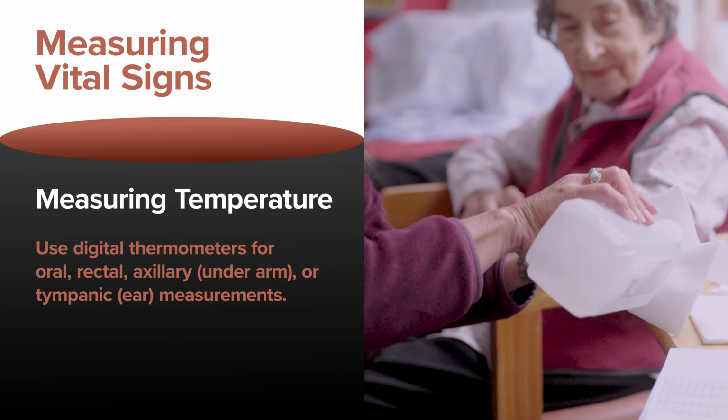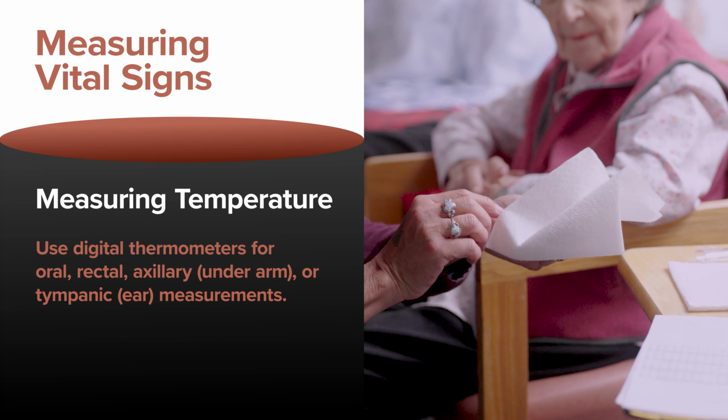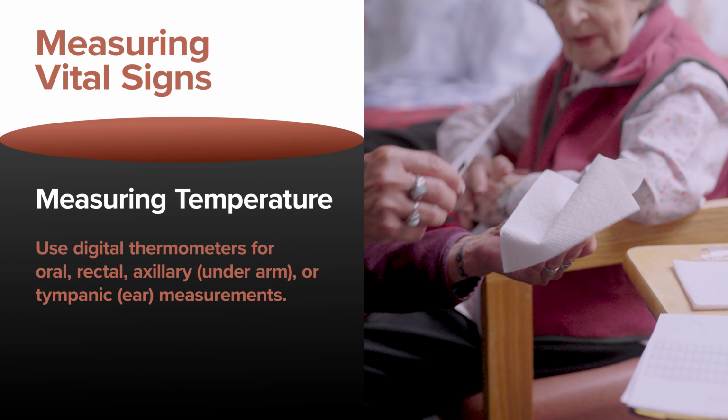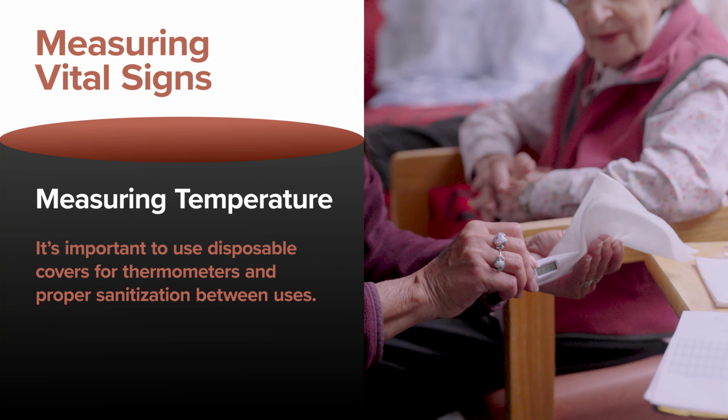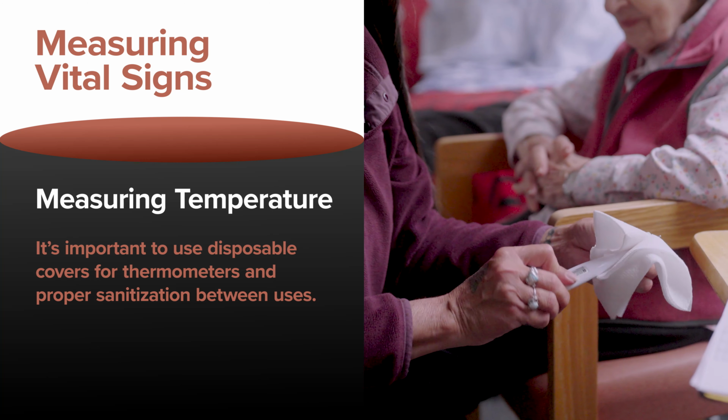Measuring temperature. Use digital thermometers for oral, rectal, axillary, or tympanic measurements. It's important to use disposable covers for thermometers and proper sanitation between uses.